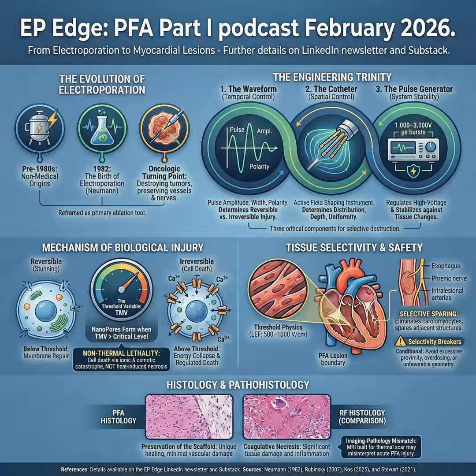Pulse width is different. Think of it as membrane charging, not just duration. If a pulse is shorter than the membrane charging time constant, the transmembrane voltage may not fully develop. Very short pulses can favor electroporation with less electrochemistry, whereas longer pulses can increase electrode-tissue interface reactions and increase muscle stimulation and pain. Then pulse number and repetition, this is cumulative injury.